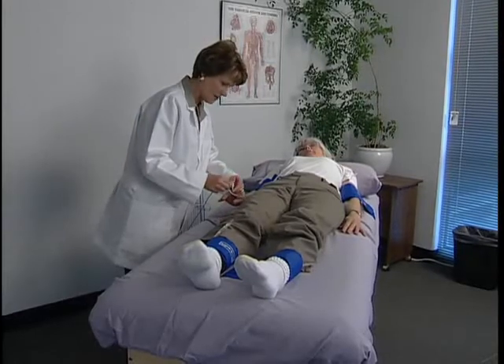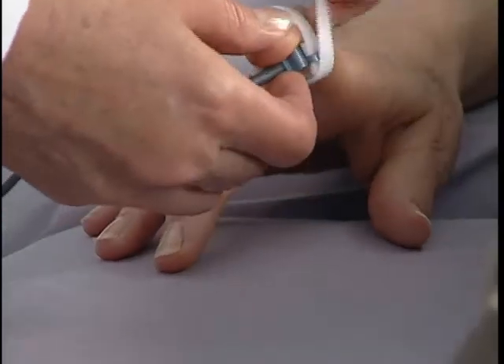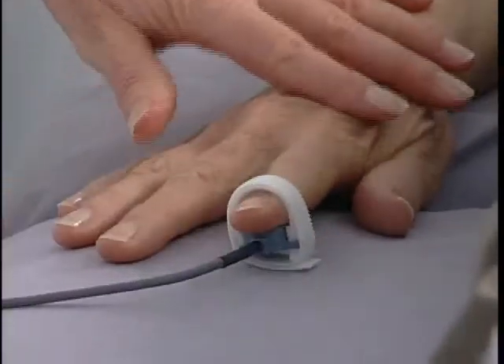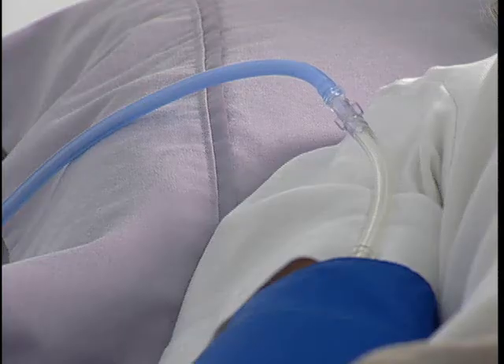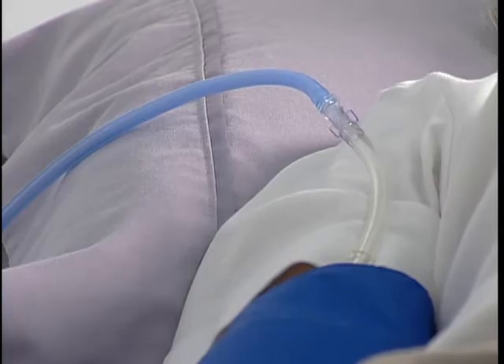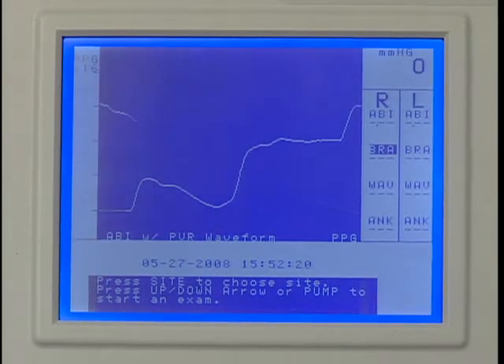Place the PPG probe on the index finger with the blue side of the probe against the skin as shown. The probe should be snug to ensure contact but not too tight to occlude blood flow. The hose should be connected to the cuff at the right brachial.